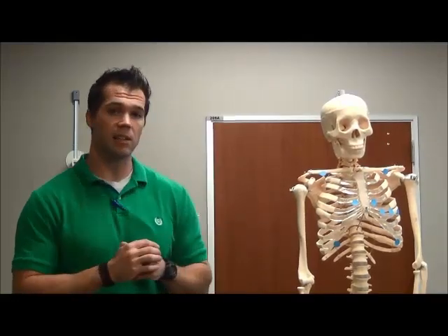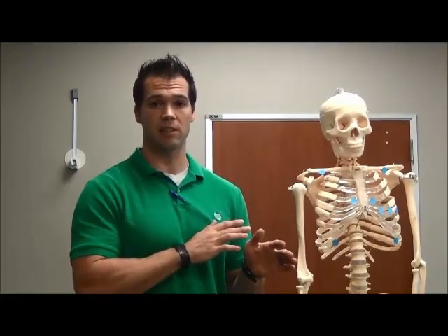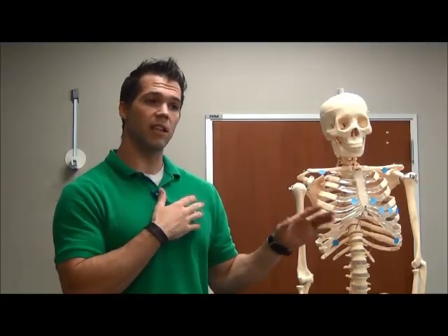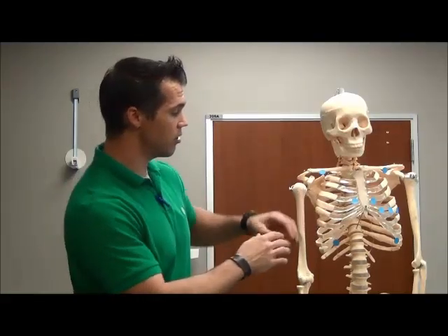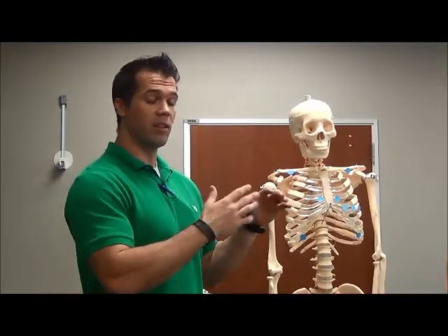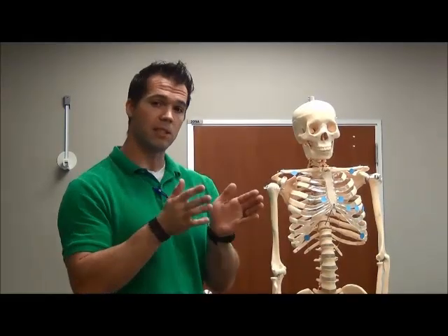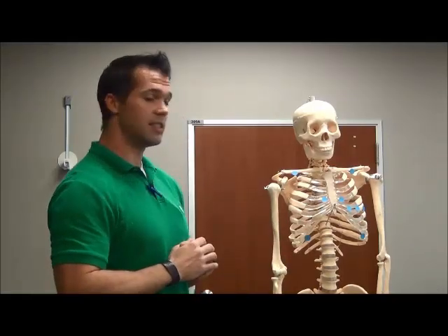So here I have a skeleton, and you notice that I have 10 blue stickers on the skeleton. Those stickers represent electrodes that you would place on the client. I put it on the skeleton because it's a lot easier to see where you would place the electrodes. These 10 electrodes actually allow for 12 different images of the heart. So when all is said and done, the cardiologist or the doctor, whoever ends up assessing the client, will have 12 different pictures of the heart based off of these 10 electrodes.